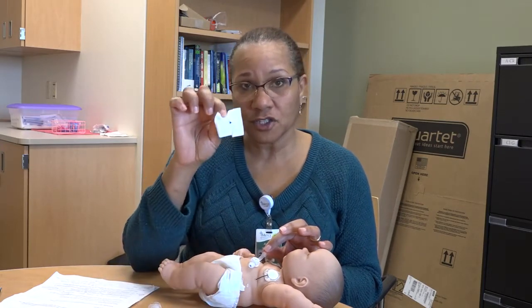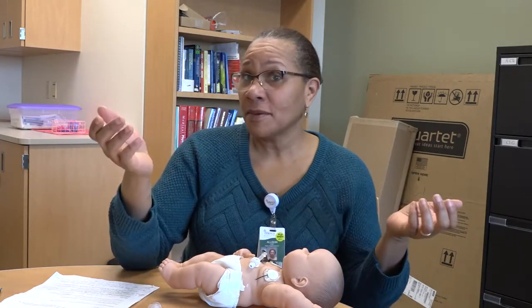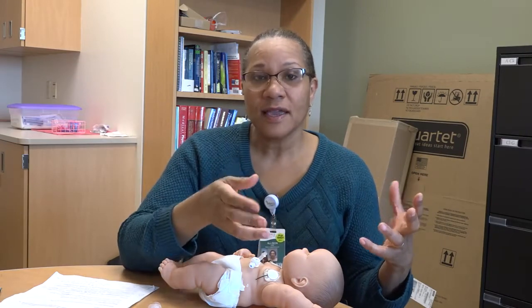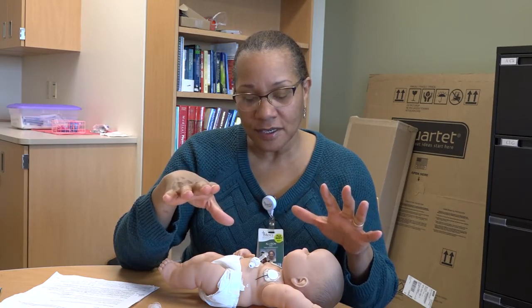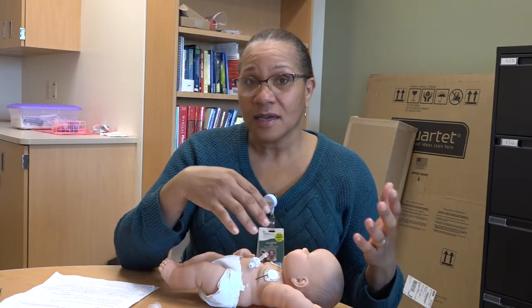But if you notice that there is some redness around this area here, and that you've noticed a little bit more drainage on your 2x2, then you're going to want to use a barrier cream around this site. So think about it like when your babies have diaper rash. We can't stop them from using the bathroom, but we can protect their skin from the contents of their stool. And it's kind of the same thing here. We can't stop all of the leakage, but what we can do is protect the skin. And the way that we do that is with the barrier cream.